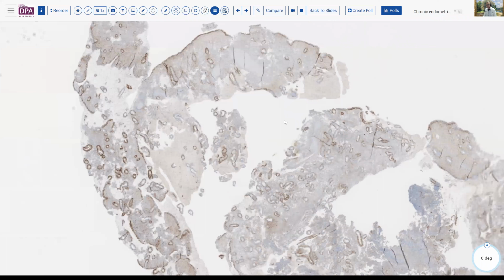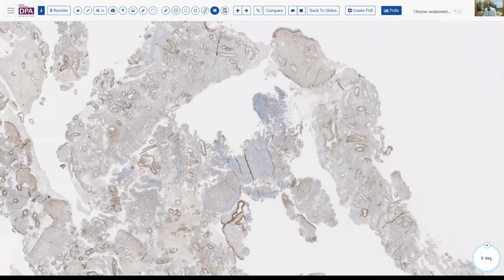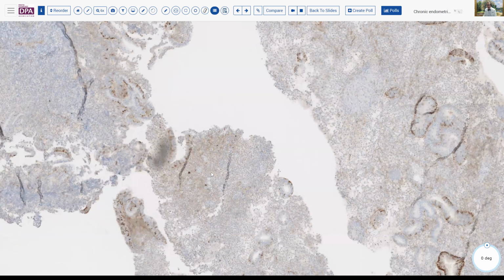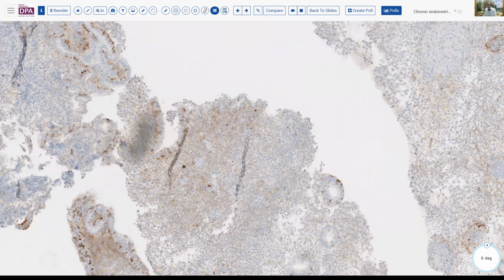And as we look around, we see there are not very many here. They're not jumping out at us from this stroma here. So many broad areas of this are free. But then occasionally we'll find an area like this, where here we've got one. And this, I think, is the value of this stain, because it can be a real time saver.